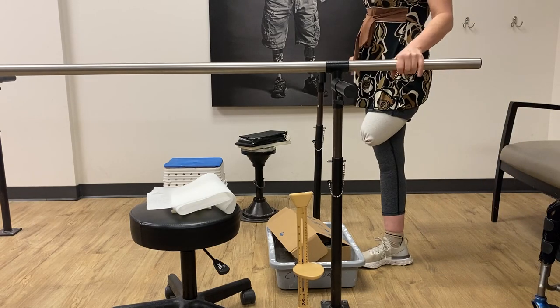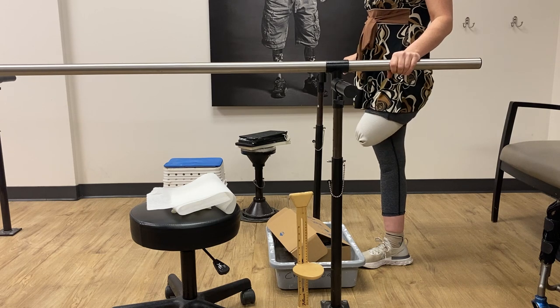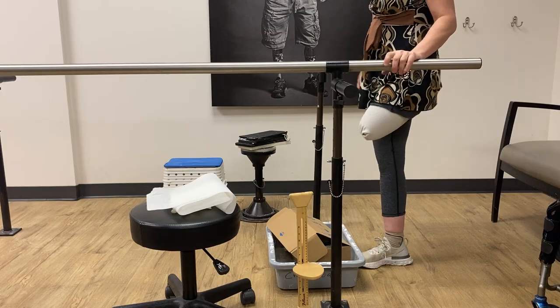Hi everybody! This is Christina, the Amputee OT. In this video, I will be showing you the process of getting casted for a prosthetic above-knee check socket.